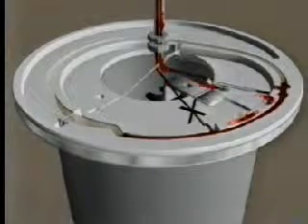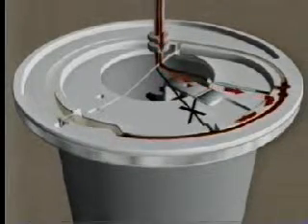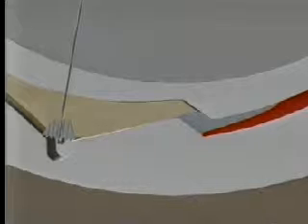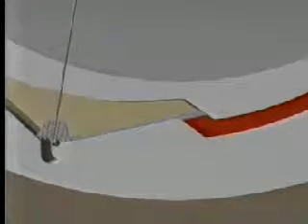During the harvest phase, red blood cells, RBCs, stored in the red blood cell reservoir of the AUPBSC disposable set, are returned to the channel. These extra RBCs raise the height of the interface until the accumulated mononuclear cells flow over the dam to be harvested at the collection port. The harvest phase is automatically followed by the chase phase.